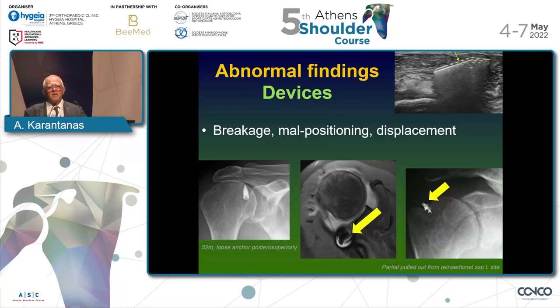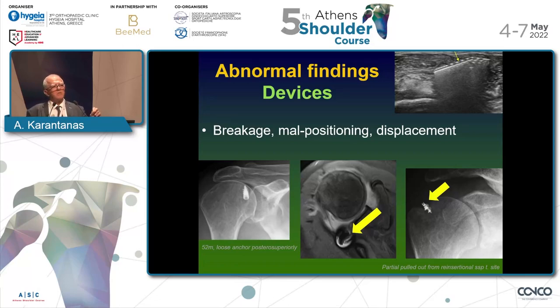Regarding devices, migration can be assessed on MRI — here a device is seen posterior superiorly in the posterior superior aspect of the joint. Usually we have joint effusion, making it easy to assess a loose body. We may have partial detachment, and on ultrasound we may see acoustic shadowing behind the metal, suggesting a metallic component.